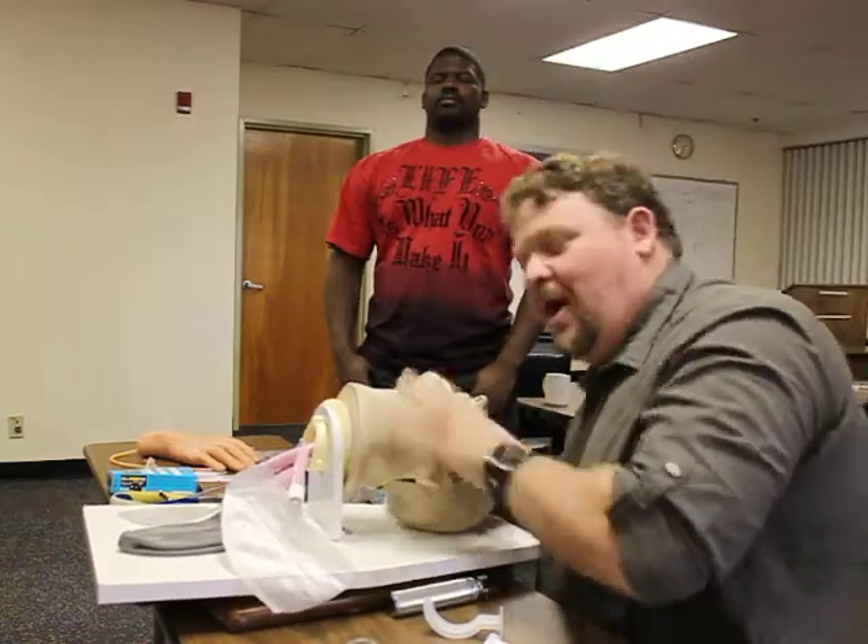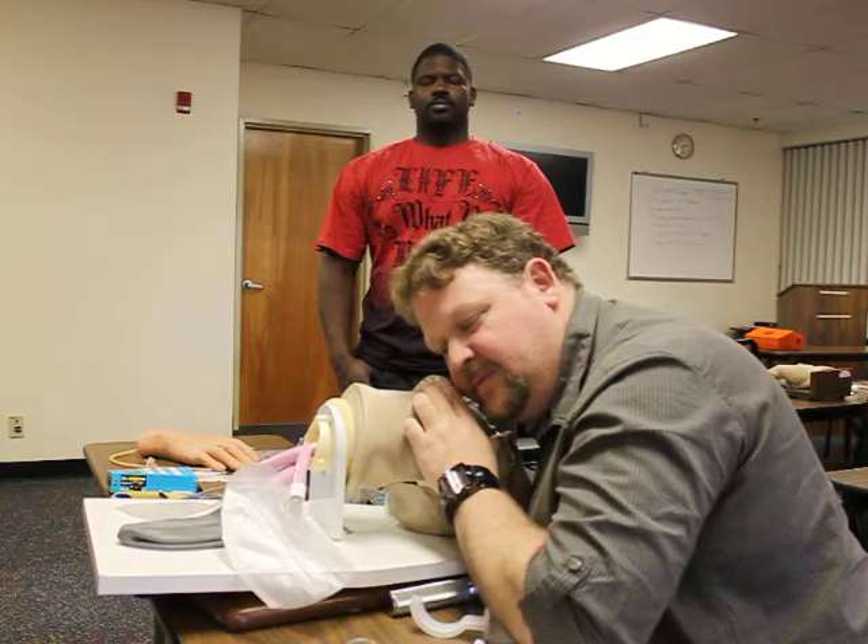Assuming this is a non-trauma patient, I'm going to perform a head-tilt chin-lift. I'm going to look, listen, and feel for five to no more than ten seconds. I do not hear or feel air passing.